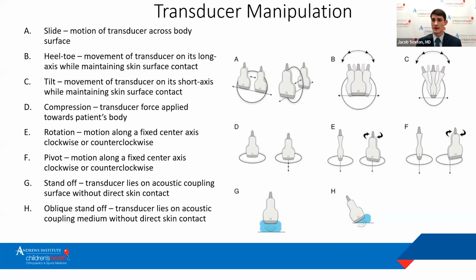It's more to allow separation of surface between the ultrasound transducer and the imaged structure that you want to see. It's usually done more for procedures if you have a steep angle that you need to approach the needle with, or if you have a very superficial small structure where putting probe pressure directly on the skin can obscure your image.